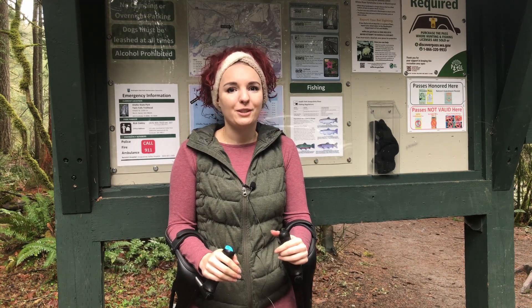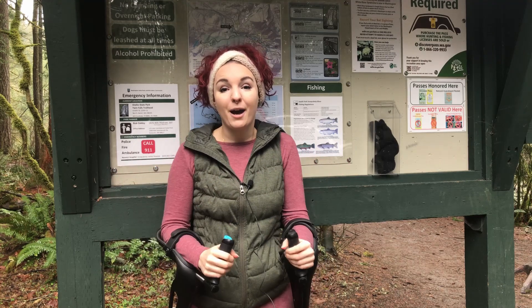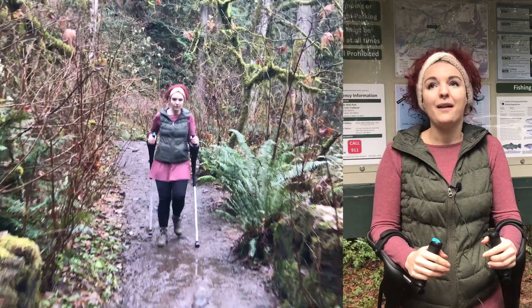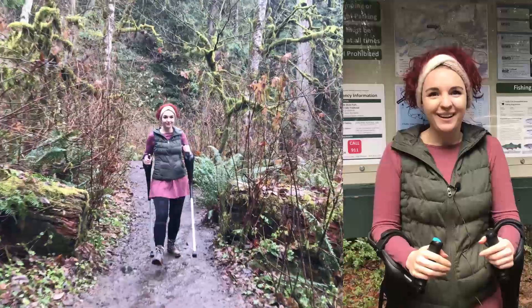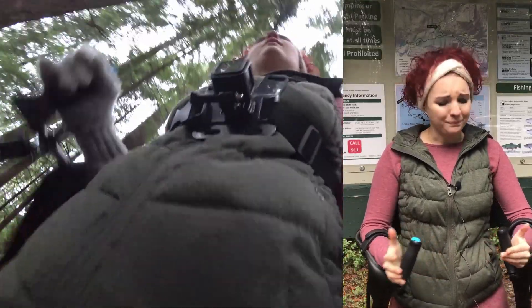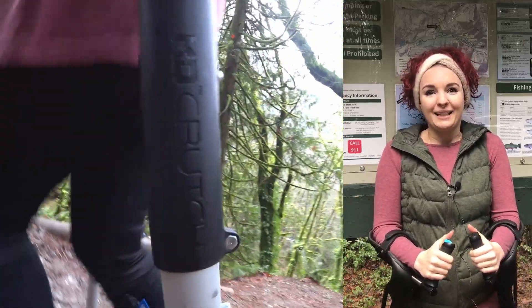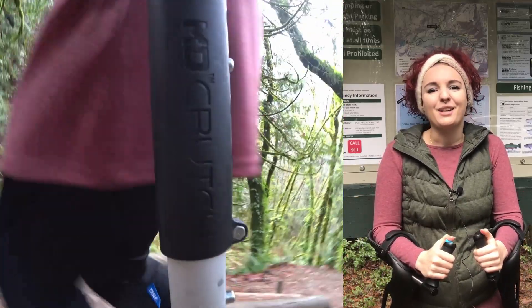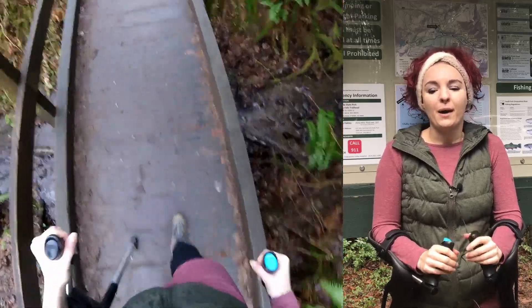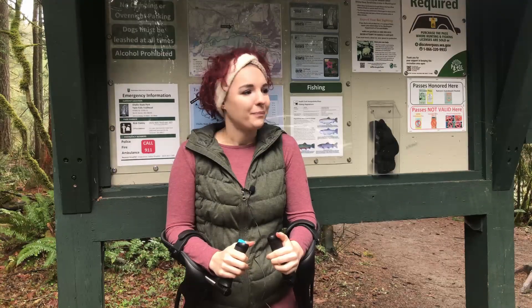A few months ago I actually did this hike in the summer with my previous forearm crutches, and I've got new digs. So it's time to test them out on the same trails — a little bit colder, damper weather. We'll see how that plays in. I want to give everyone a good review of how this hike goes and we'll just see if I can make it to the top, honestly. However far I make it is however far we can all make it, right? So let's get going.